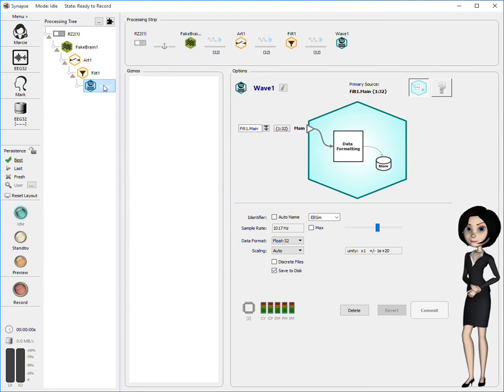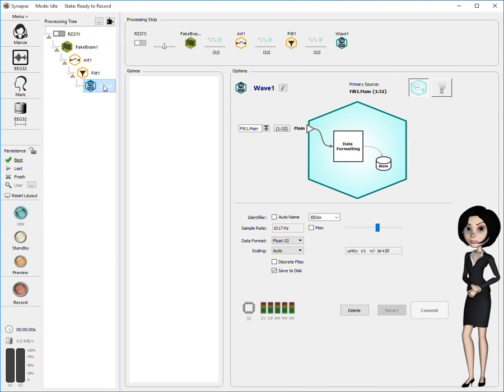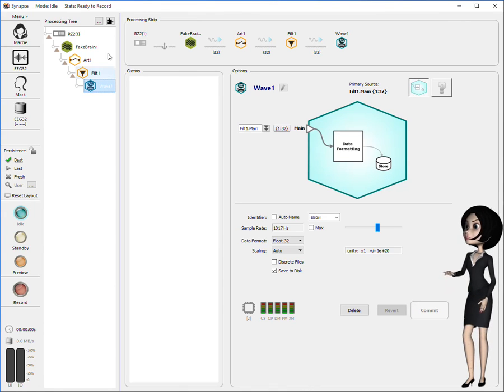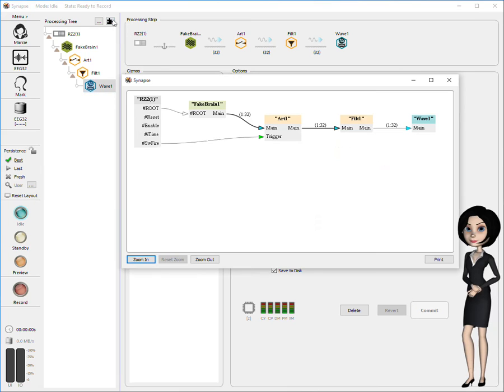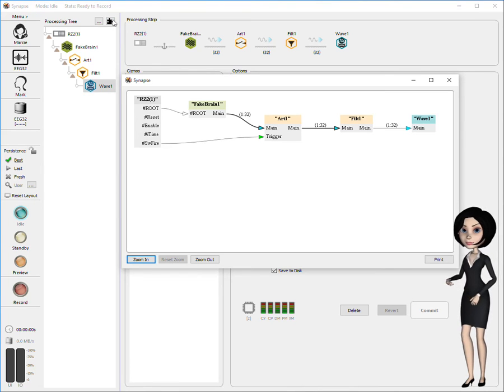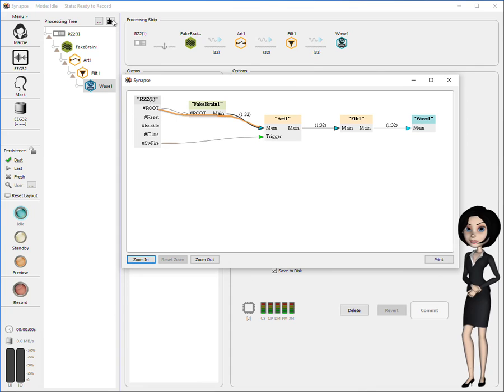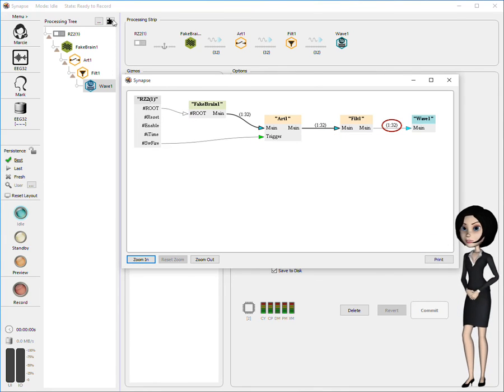Synapse has a third very nice way to look at all connections between the components of your experiment. At the top of the processing tree, click the puzzle piece button to show this additional view. The connections diagram shows both the primary and secondary signal connections within an experiment. Additionally, this diagram depicts signal types and signal channel counts. More on that in another demo.